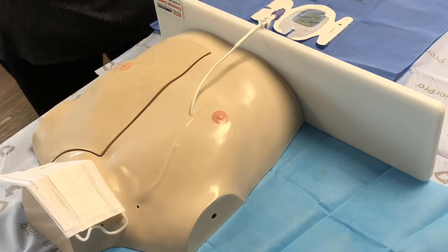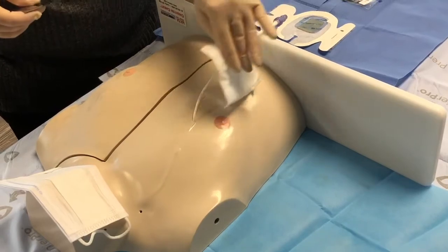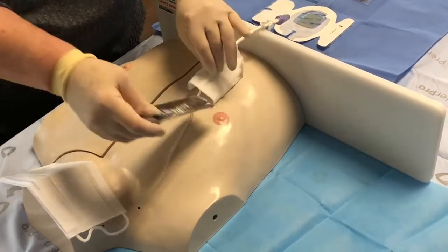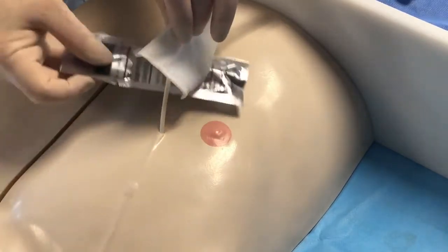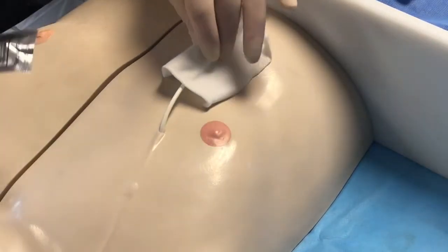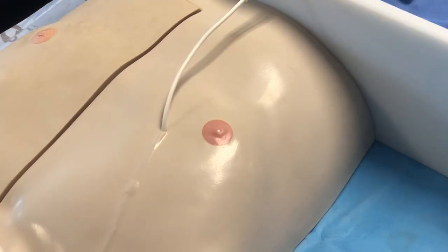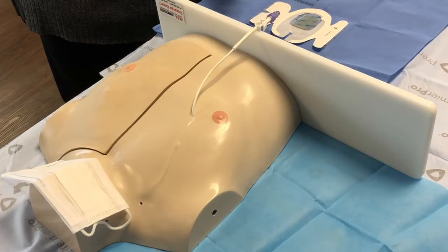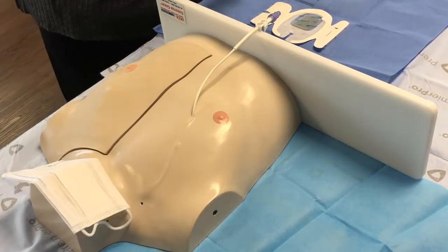Open the skin protectant package and use the second 4x4 to handle the catheter. Place the skin protectant to the skin that will be under the dressing, but not under the chlorhexidine gel pad, and the adjacent skin. Allow skin to completely dry. If you're going to utilize the stat lock, apply it now and ensure that the catheter is not dislodged.